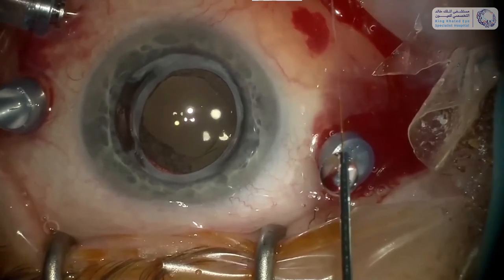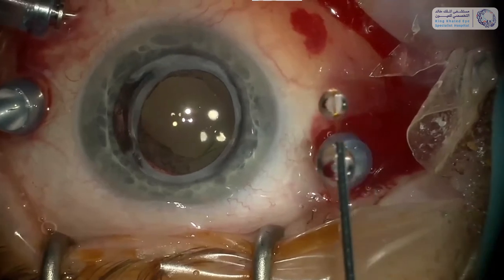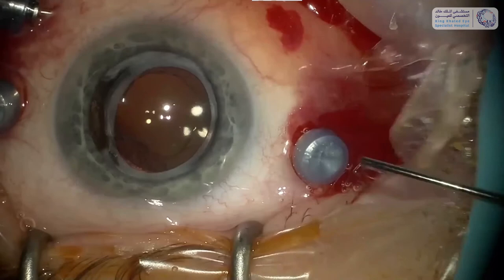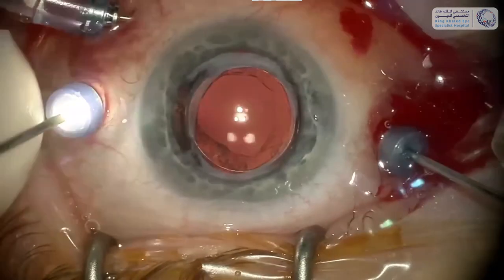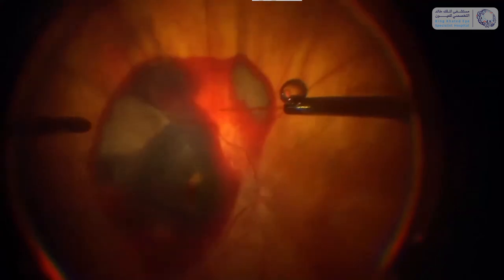This is the tool that we use. It's from DORC and it's a 41 gauge needle which can be extended from a 23 gauge shaft. We have connected the needle to a silicone oil pump.